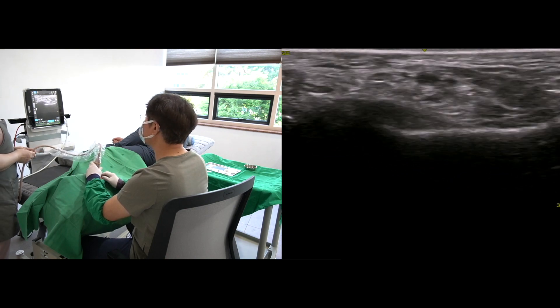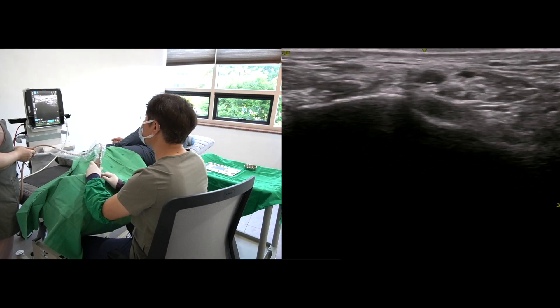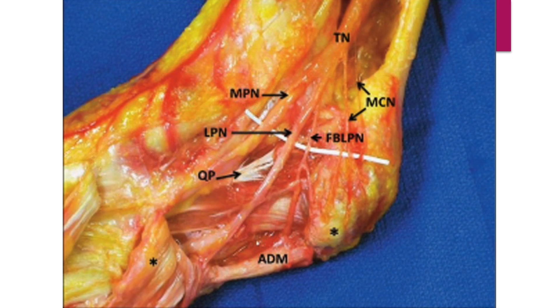Let me explain the anatomy of the medial ankle. The tibial nerve splits into medial plantar and lateral plantar nerve at the tarsal tunnel.